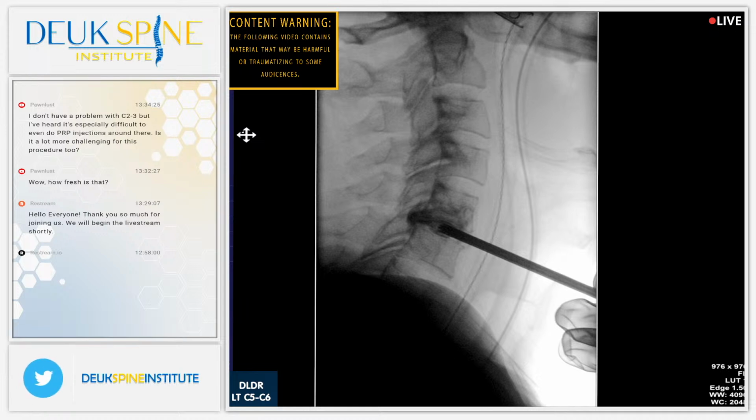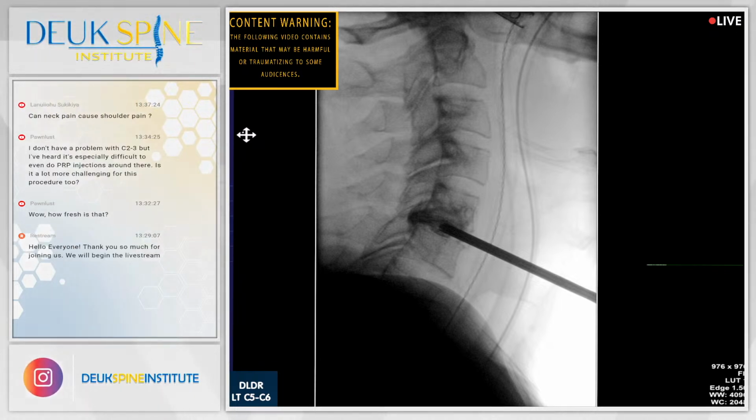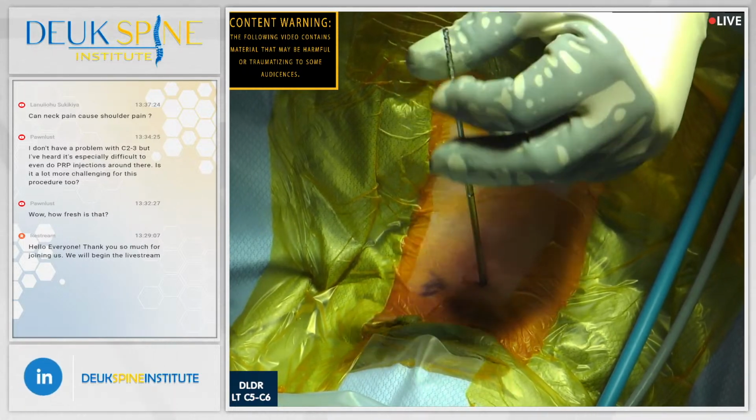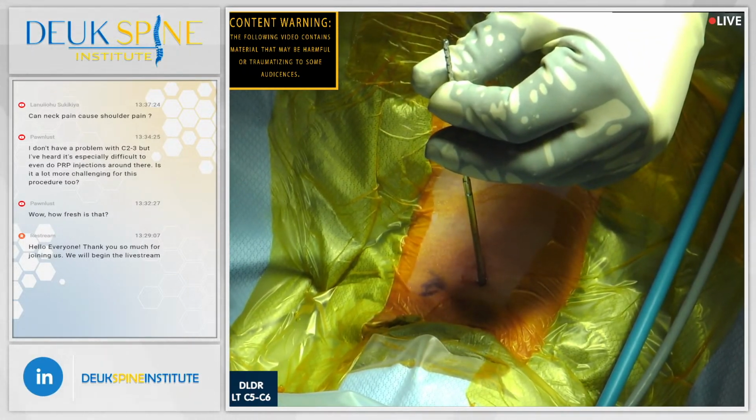Okay, just so you know, the dilator is getting shoved back up the tube. See that? Shot? I'm putting it in and it's popping back up. Why? Because there's so much pressure inside this disc. Look at that. That's crazy. This disc has so much inflammation happening right now that it's literally shoving this thing back out.